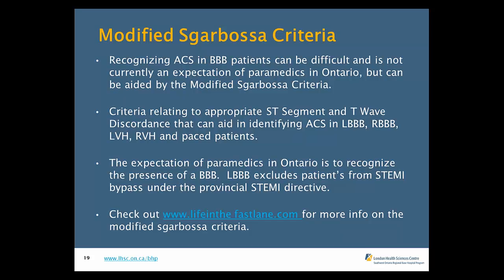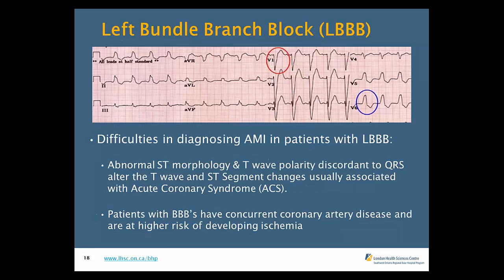hypertrophy. And Mike, can you just go back to the slide showing the left bundle branch block as well? Again, I cannot stress this enough. It's the muscle memory that occurs when you see ECG after ECG after ECG. When you don't have that experience, you look at this ECG at first glance and say, wow, this looks absolutely ugly. Look at this ST elevation. Looks like there are flipped T waves.